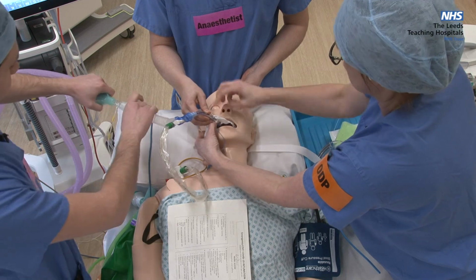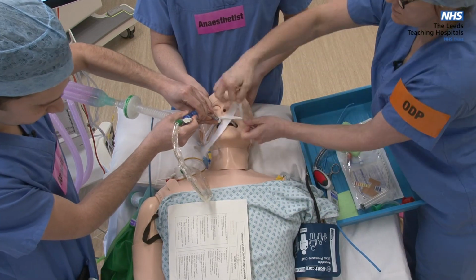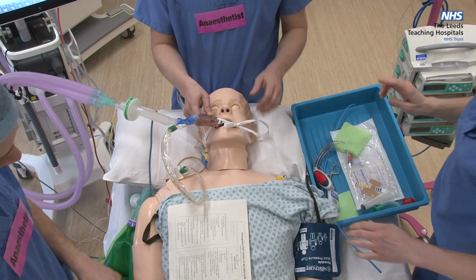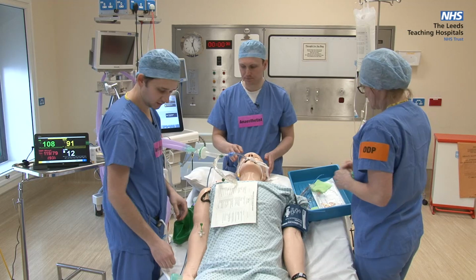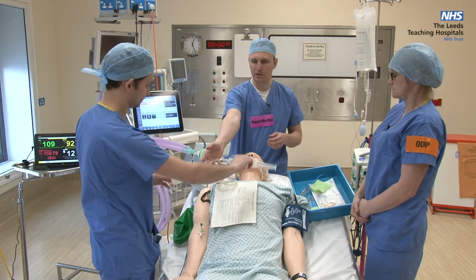So we're going to push and twist to make sure all the connectors are fitted together tightly. And we're going to tie the ET tube in place. So that's secure. At this point, we're going to commence maintenance sedation. So I'll start to set that up. Okay.